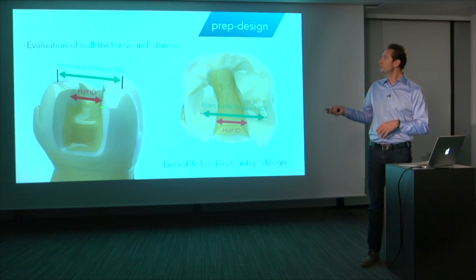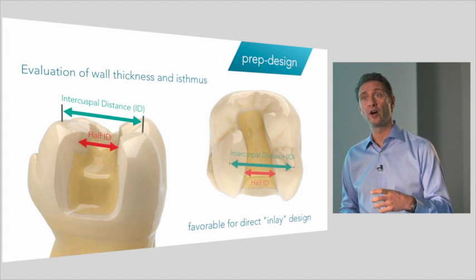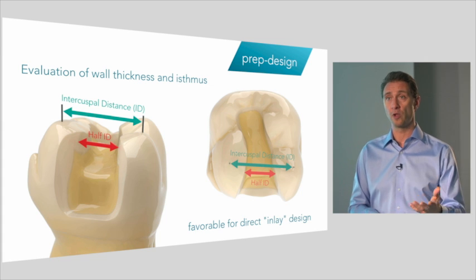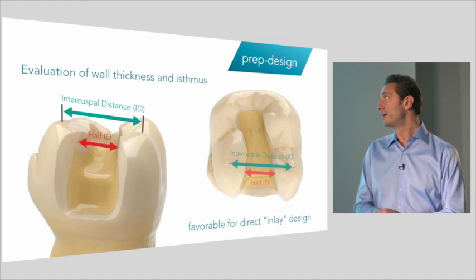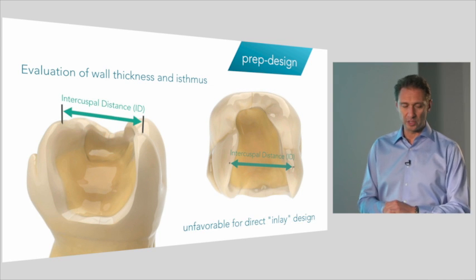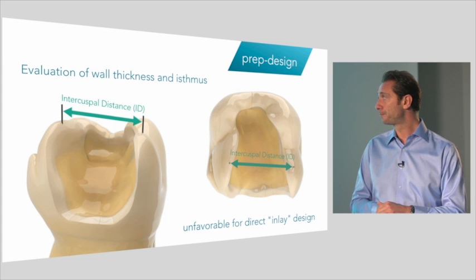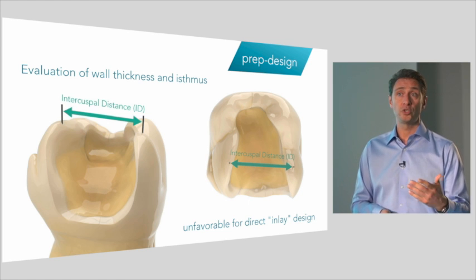This means that the surrounding tooth structure here is thick enough, strong enough to function with the restorative material inside. The criteria for this is pretty obvious. It's 2 to 2.5 millimeter of wall thickness that we need for that wall to have very good intrinsic strength left. It's clear that if we don't respect this cavity preparation, and if the preparation ends up wider than this, if we end up with walls which are very thin, maybe undermined, only consisting of enamel, there will be some biomechanical issues and failure.